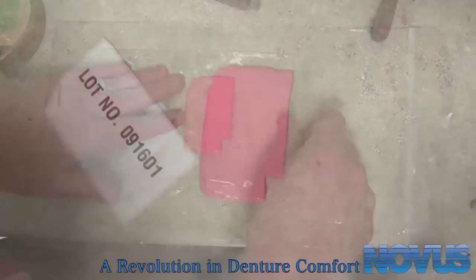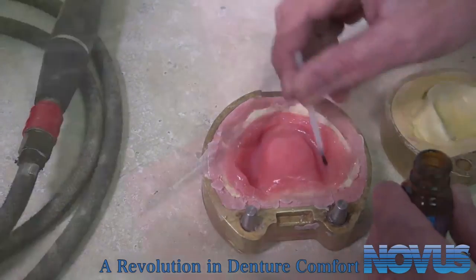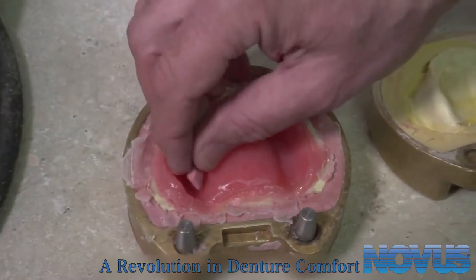Now, prepare the Novus by bringing it to room temperature. Apply Novus Bond liberally to the host denture. Then, apply Novus material.